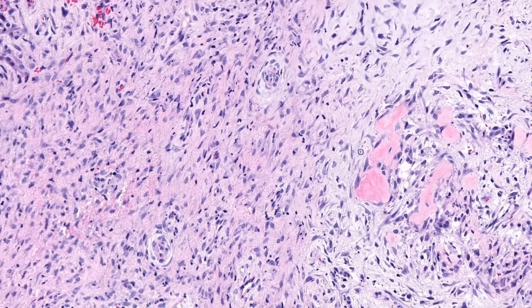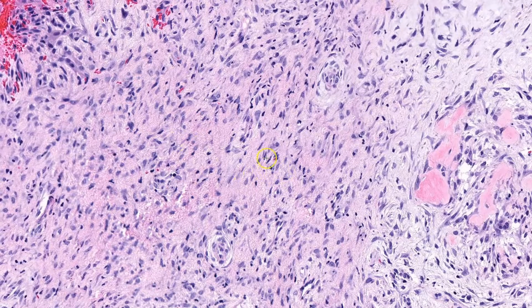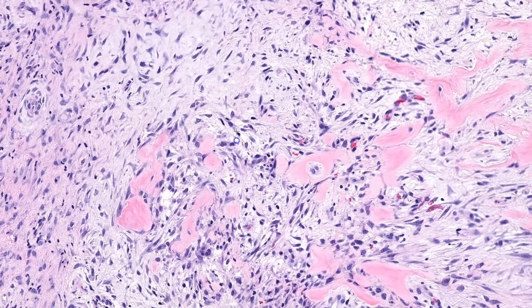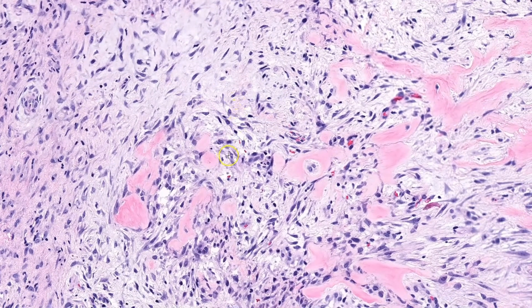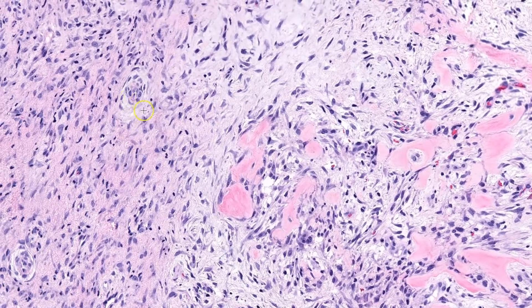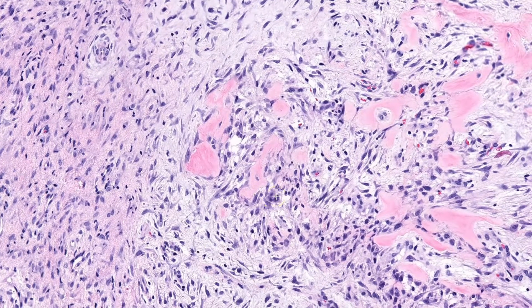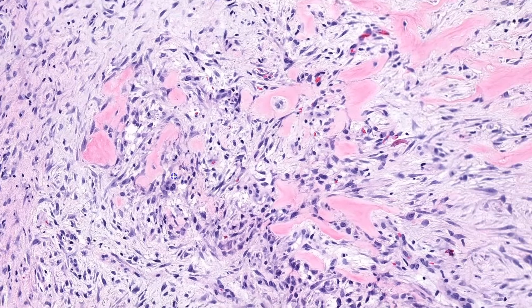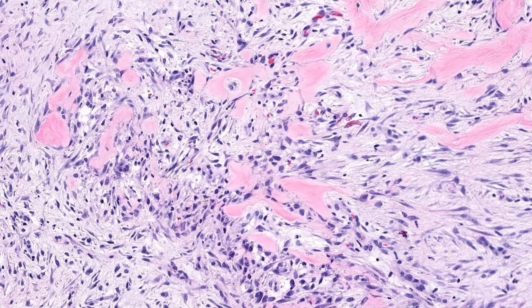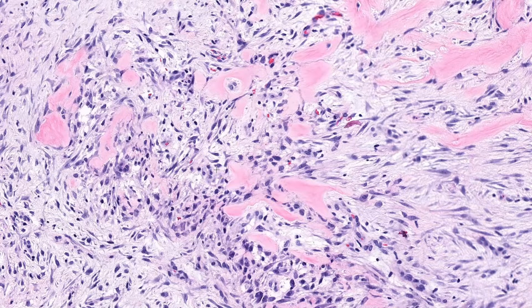You can see in some areas they're more collagenous, with the cells arranged in short fascicles, and there are other areas that have a looser, more feathery arrangement within a myxoid background. Additional features I notice are some scattered inflammatory cells, some small but reasonably prominent blood vessels, as well as some scattered multinucleated giant cells. The cells themselves appear relatively uniform with an ovoid to cigar-shaped nucleus, central punctate nucleolus, and a moderate amount of amphiphilic cytoplasm.